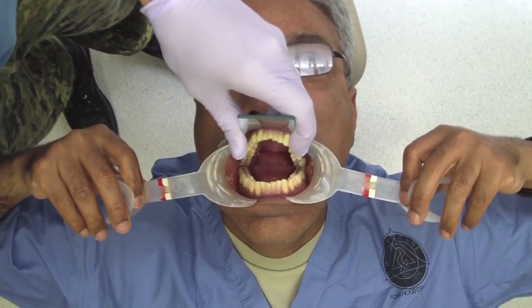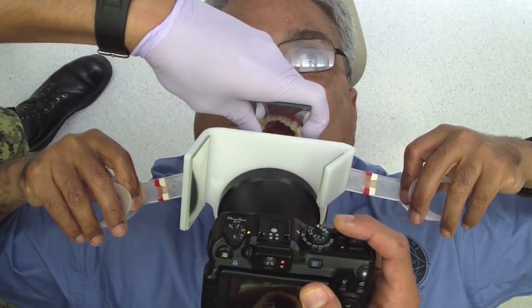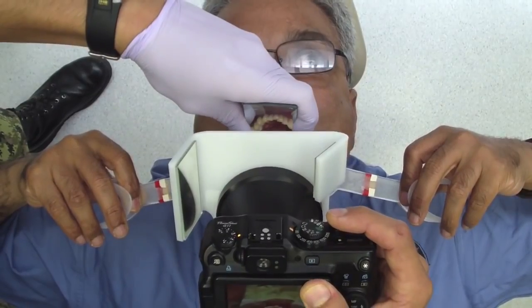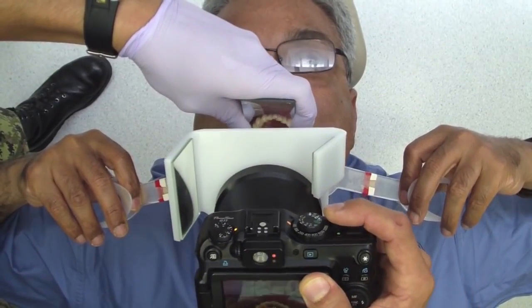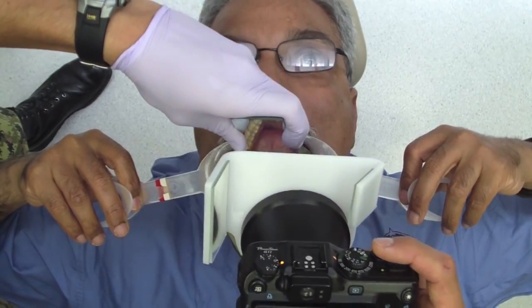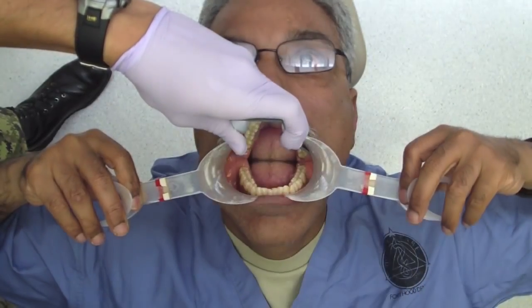And same with the mandibular arch. I'm going to just get you to turn those down like a smile, and you see how it opens up and it pulls the lips away from the mandibular teeth. It's a neat little trick. Just open big for me. There we go. My mirror is starting to cool down, so let's just grab a quick photo here. And these are very helpful for treatment planning, as Dr. Saini and I know. You can walk away and then be able to treatment plan the patient afterwards.